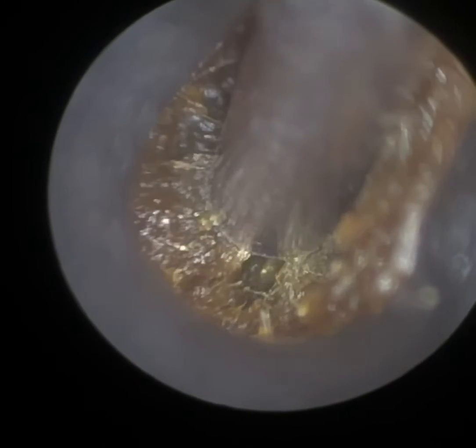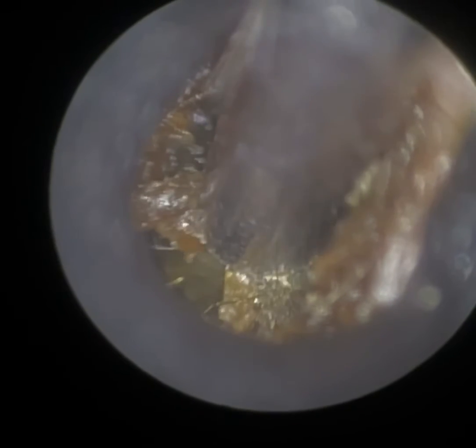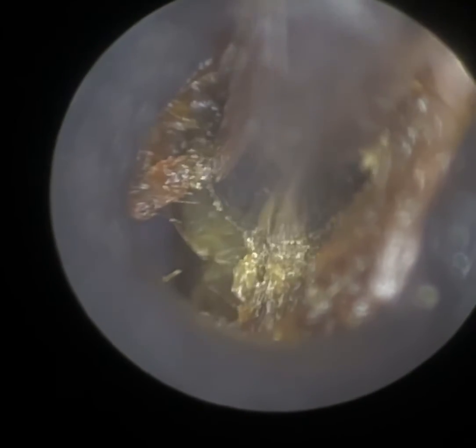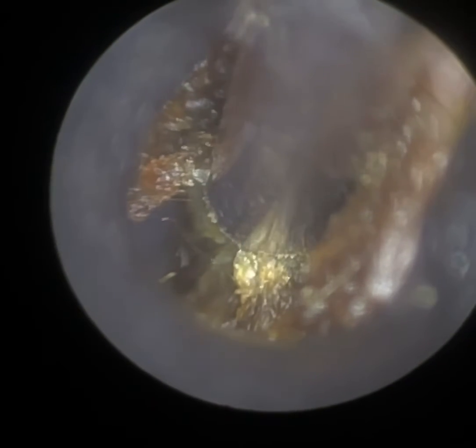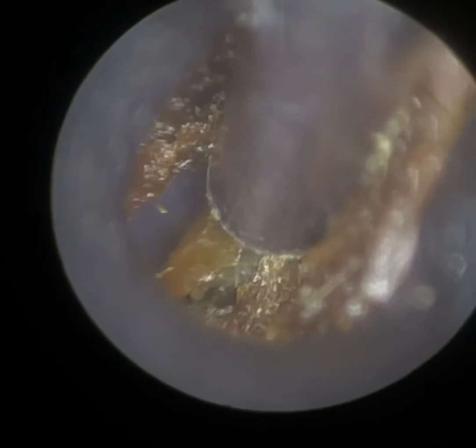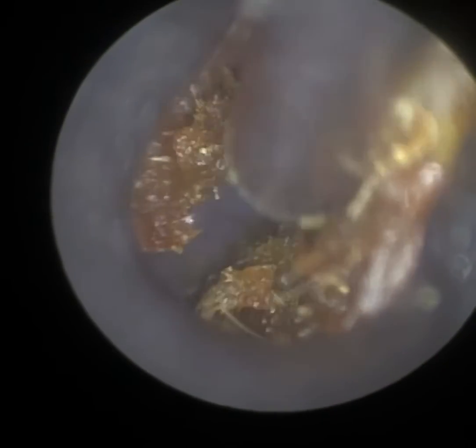I'm just using our 4.25mm speculae. We've got a smaller size, a 3.5mm, and two larger sizes, a 5mm and a 5.75mm. This wax was really, really impacted on the eardrum. You can possibly just see at 9 o'clock some of the posterior aspect of the eardrum coming into view.